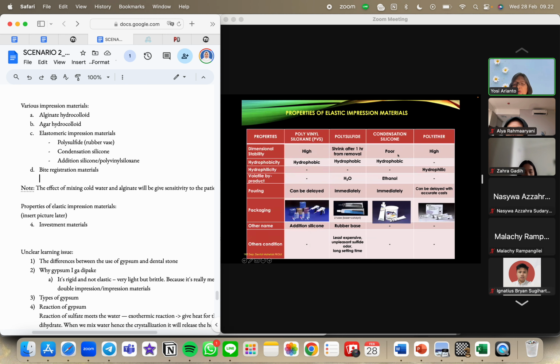Condensation silicone also is not very popular because it has poor dimensional stability, and it also has a volatile byproduct of ethanol, and it should be poured immediately with the gypsum. Okay, polyether is really quite popular now because the dimensional stability is very high.